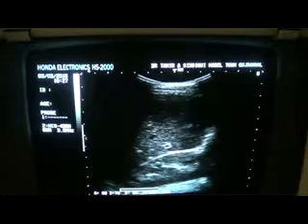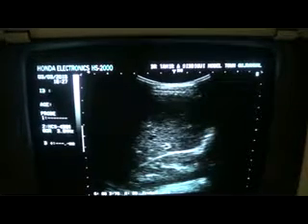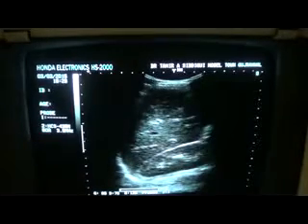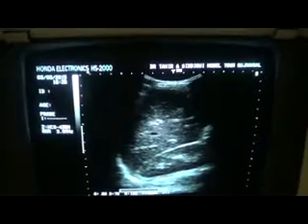This is a normal kidney. You can clearly see the capsule, the parenchyma, the cortex, the medulla and pyramids. Corticomedullary differentiation is intact. There is nothing wrong with this kidney. If you can't assess it in this position, go to the prone position. In prone position, you can see that the parenchymal echogenicity of the renal cortex is normal.